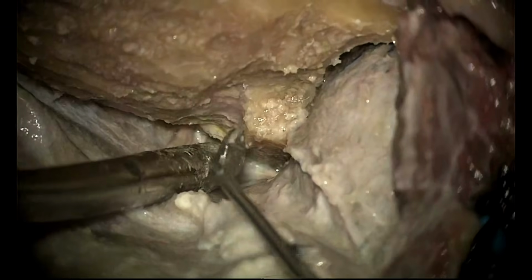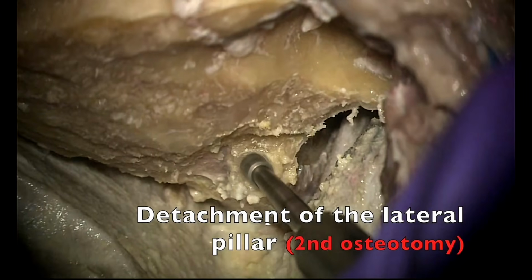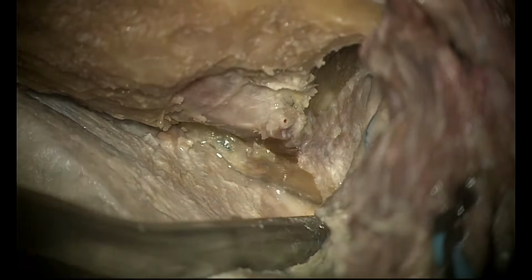artery. So here we see how the optic canal is fully decompressed, and now the roof of this optic canal is removed with this non-drilled technique, and the lateral osteotomy and the osteotomy between the sphenoid ridge and the optic canal are then connected. At this stage, the anterior clinoid process remains attached only by the optic strut.